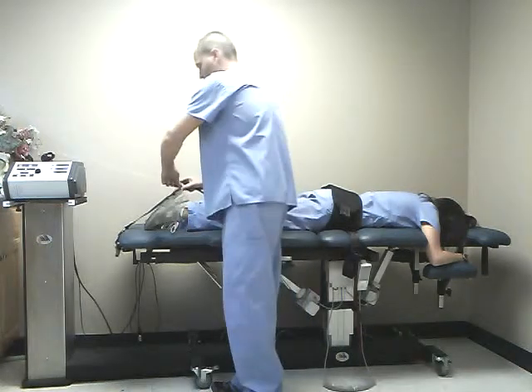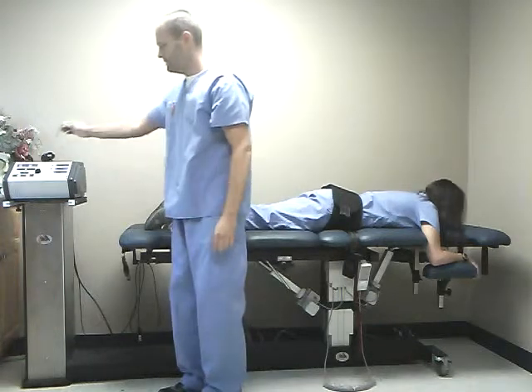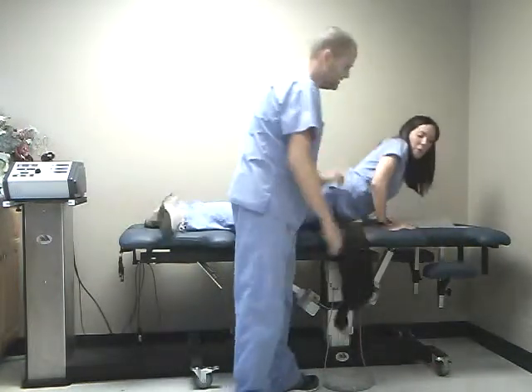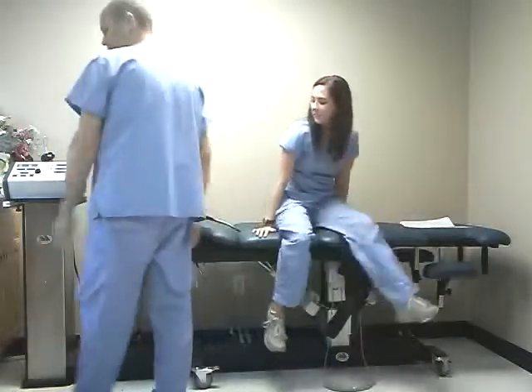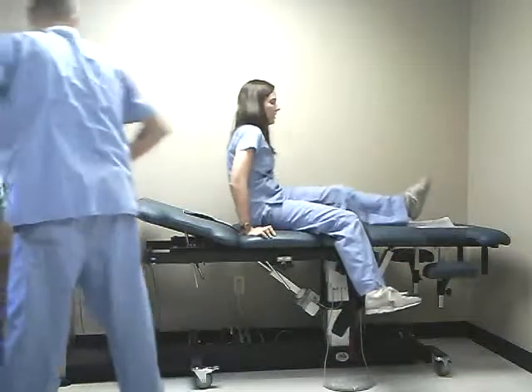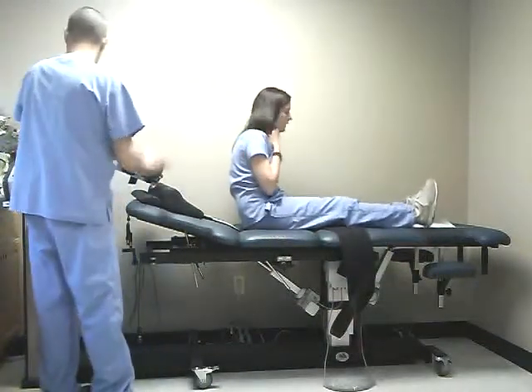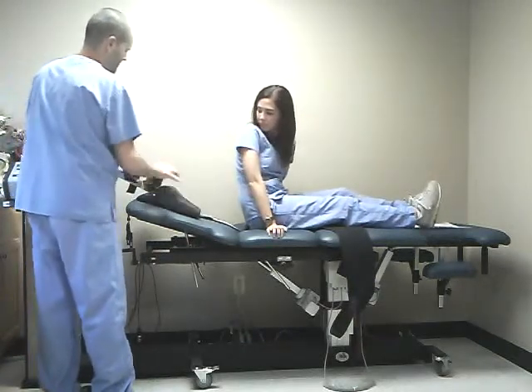Now we're also going to show you how we can do cervical traction for problems with the neck. So Meredith's going to raise up here and swing around and lay onto your back for me. Just lay your head there.